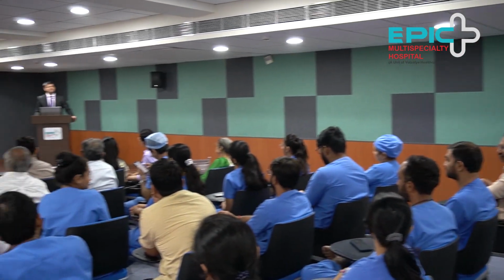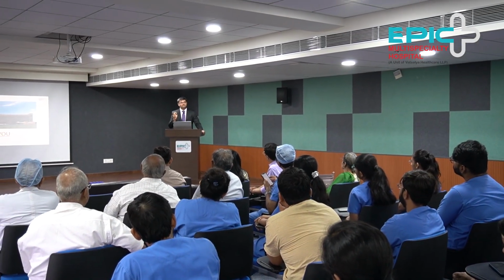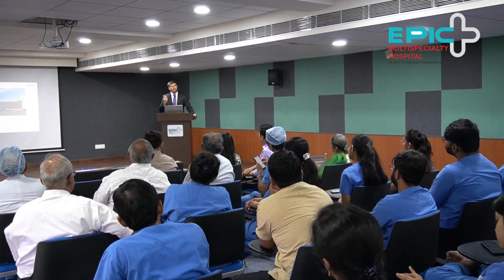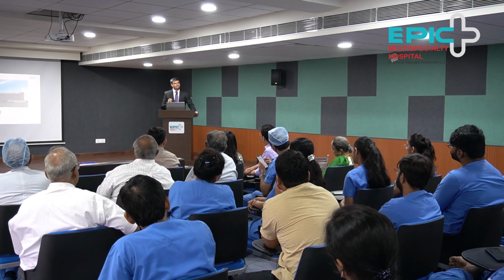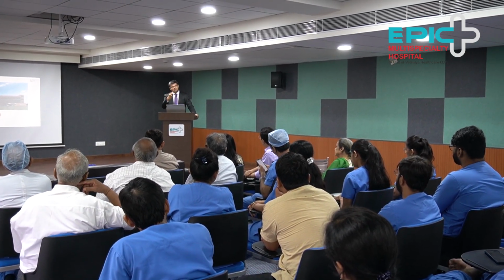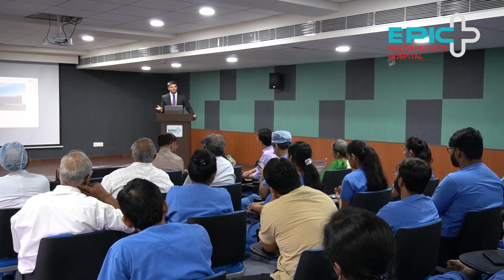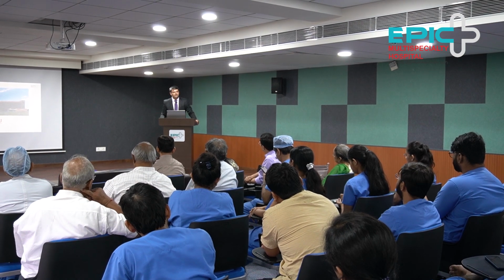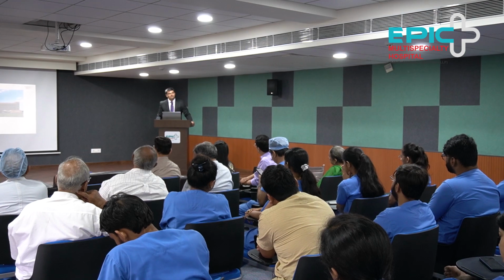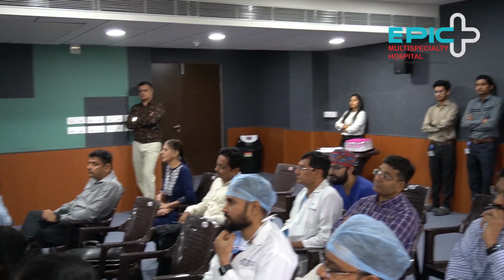There was one important case of tuberculous lymphadenitis with coagulative necrosis, where there was a mediastinobronchial fistula after EBUS, because there was pus there, and they removed the pus, but it was continuously coming. But it healed very beautifully after 3 weeks of antituberculous therapy. So there was a small risk of mediastinobronchial fistula after EBUS. But this is very rare, sir.